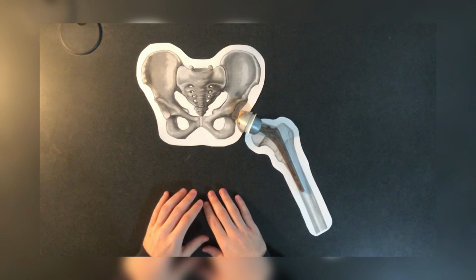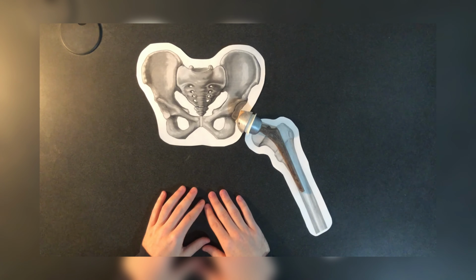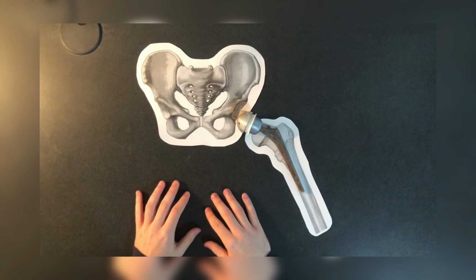The surrounding tissues and muscles are carefully sutured back into place, and the surgery is complete. Throughout the assembly process, precision, attention to detail, and adherence to strict surgical protocols are paramount to restoring mobility for the patient.